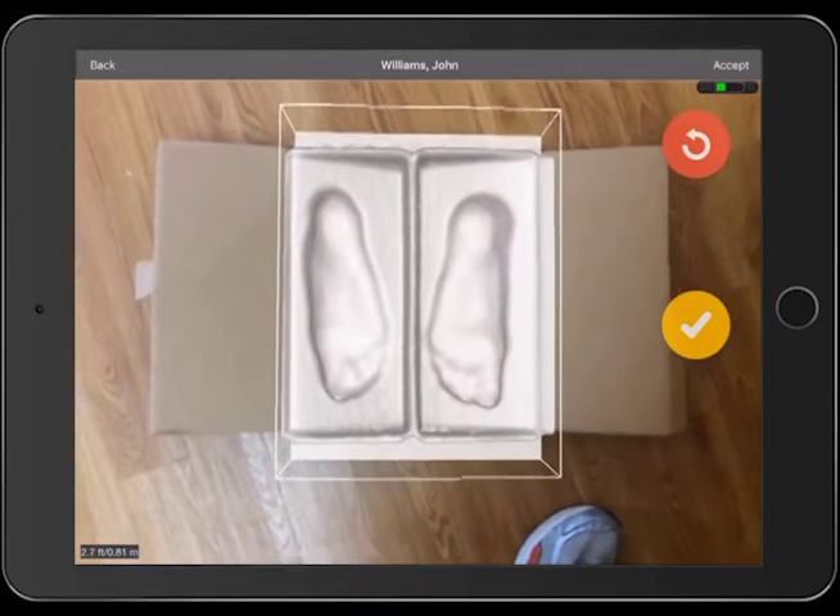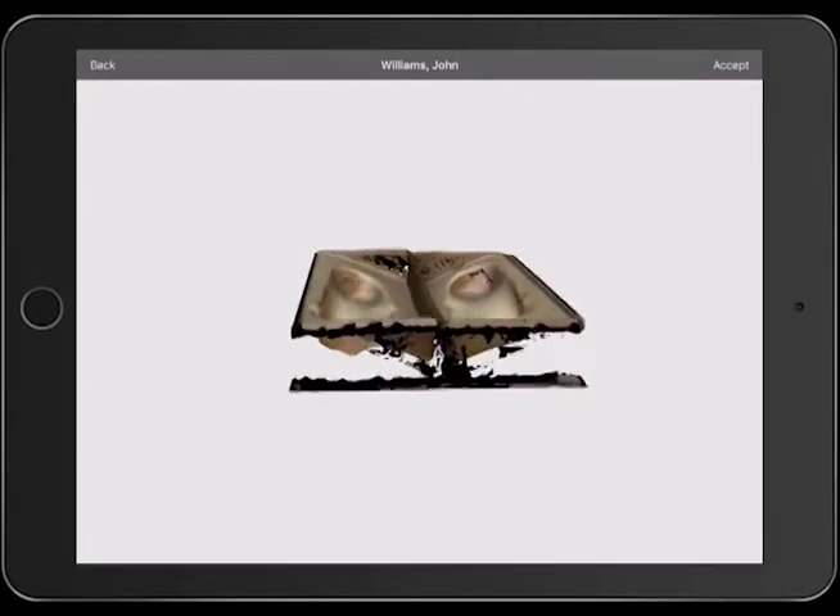When you are satisfied with your scan, tap on the yellow check mark to view your scan.